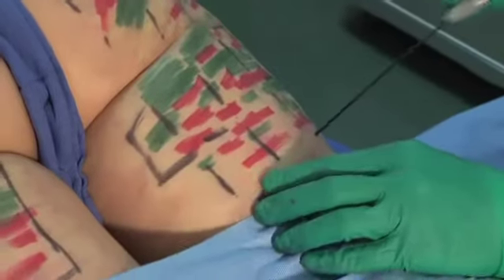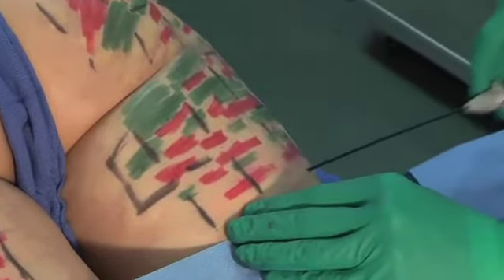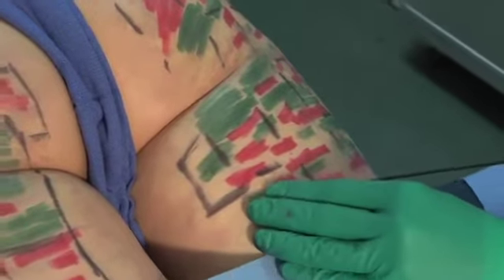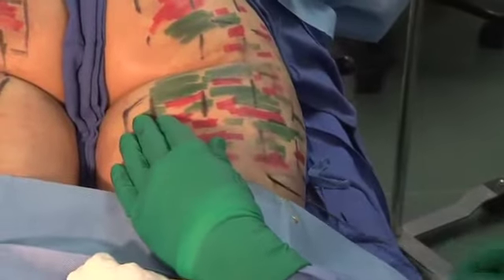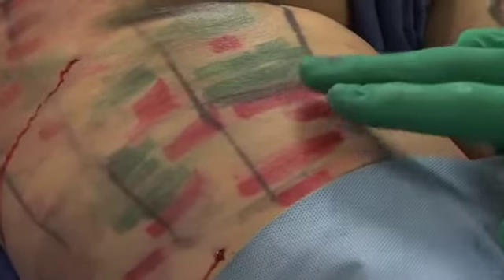The red areas of depression, I'm going to cut across the fiber septi, and I may do that in more than one direction as I feel it release. If I feel that there's a catch somewhere, then I'll turn the fiber in the other direction and basically try and release that zone. And you can feel it release, and you can even see that that area of depression has come up. In comparison to the other side, which hasn't been treated yet, you still see the hills and the valleys as defined by the green and the red. But that subtle undulation that's occurring here in the skin, you can still see. We know that we've got a very good release on the other side that has been treated. We know that we've smoothed things out considerably.